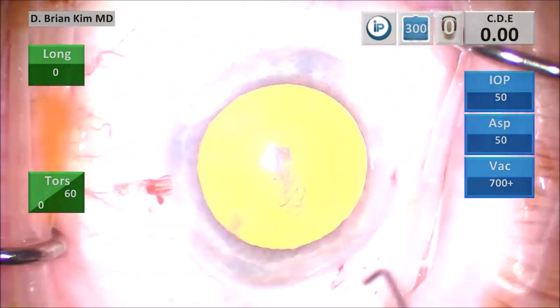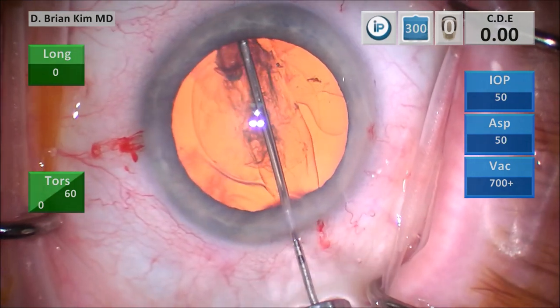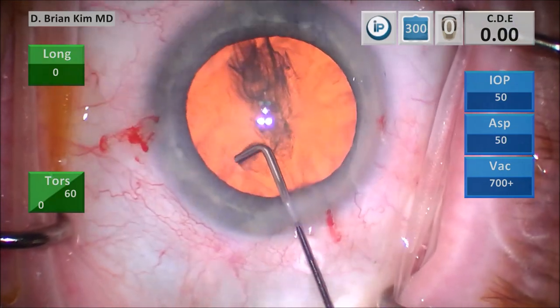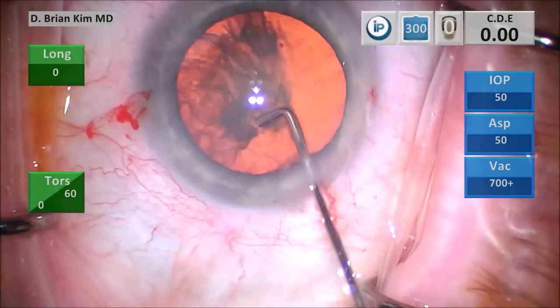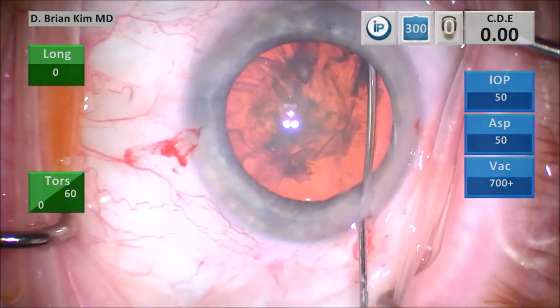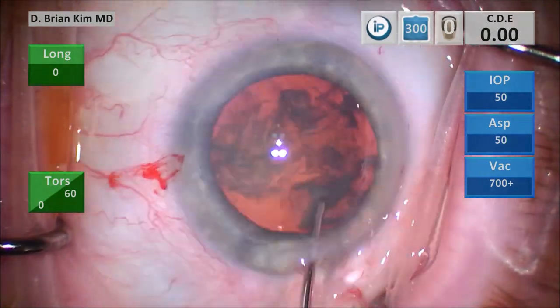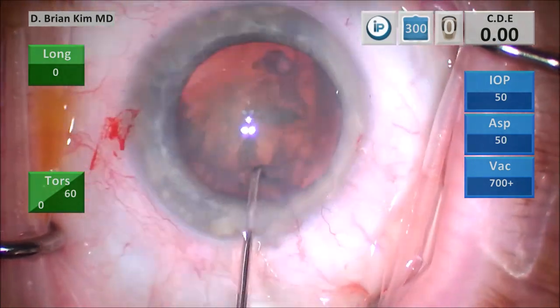I like to burp some viscoelastic after I do my rhexis to help me with the hydrodissection. This is my capsular fornix hydrodissection technique. I place the cannula out to the contralateral equator, point the cannula tip down, and get a nice fluid wave. I'm sweeping on the left side and trying to turn the lens on the right side. You can see it's taking a little bit of effort, and then gently I'm turning the lens. You can see the lens is spinning, but it did require a little bit of effort.